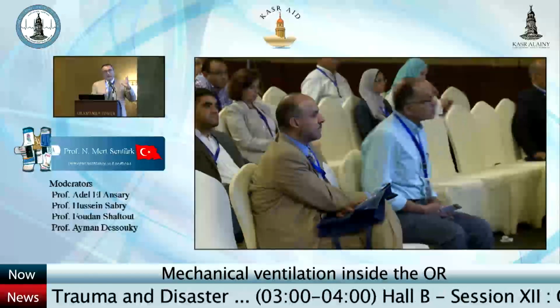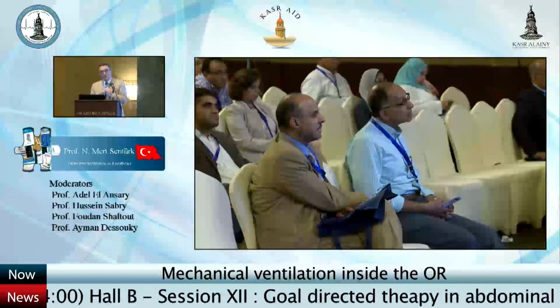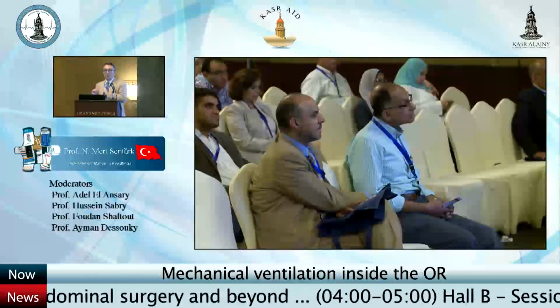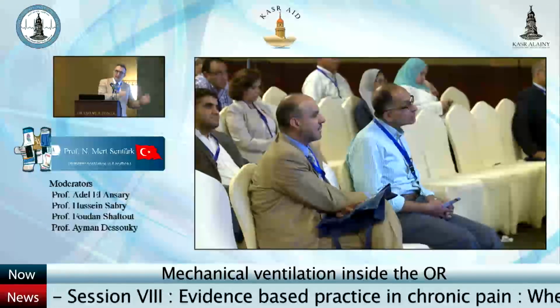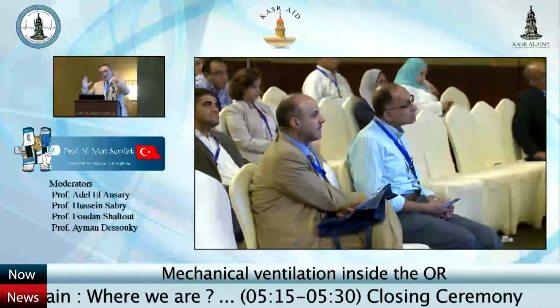Probably, the newer anesthesia machines are capable of supplying this homogeneous distribution of ventilation also with volume controlled ventilation. The name changes from company to company, but it is the same thing: a pressure regulated volume control.